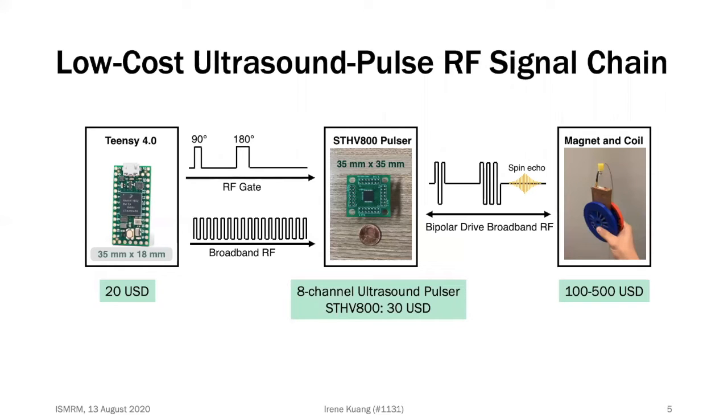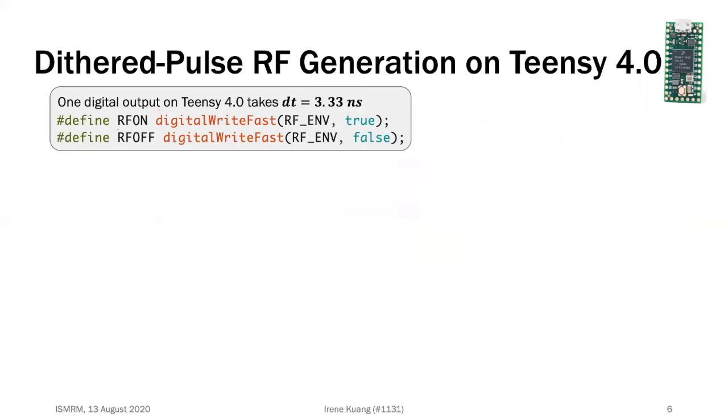Because each channel is driven by 2 digital bits, the chip can be enabled by square wave inputs from an inexpensive Teensy 4.0 microcontroller. The adjustable 600 MHz ARM processor of the Teensy provides dynamic clock scaling and allows for reliable generation of square wave pulses using the command digitalWriteFast. This particular command has reproducible and precise timing, and despite the 3.3 nanosecond constraint between instruction cycles, we can carefully control the RF output to properly excite a bandwidth of frequencies.